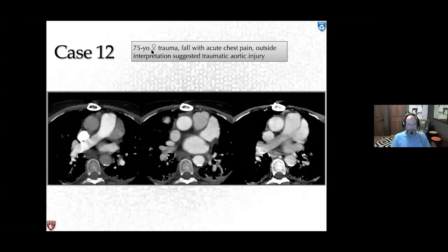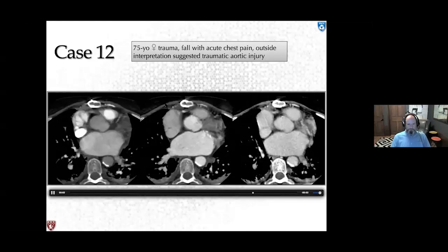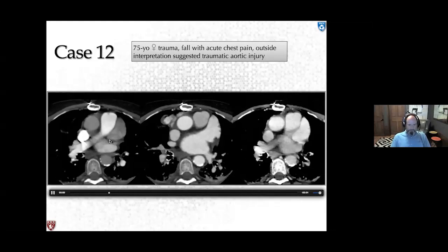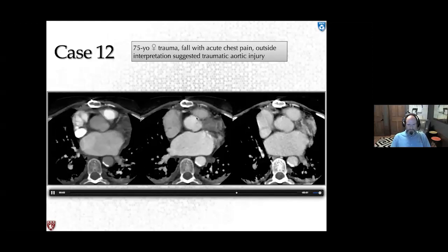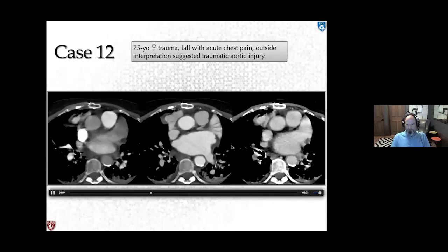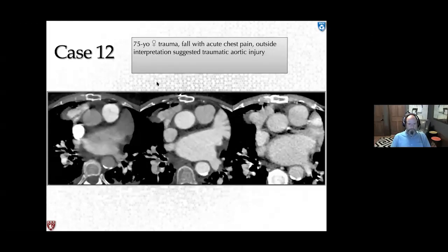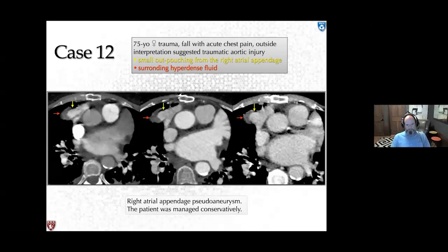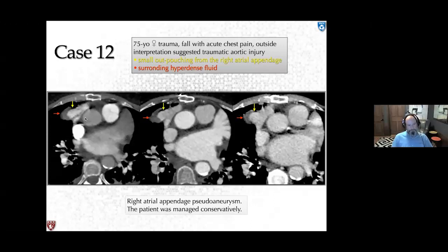Case 12: a 75-year-old female with history of trauma and acute chest pain. Outside interpretation suggested traumatic aortic injury. Three-phase CT showed a small outpouching from the right atrial appendage with a focus of hematoma and surrounding hyperdense fluid — a right atrial appendage pseudoaneurysm, which is very rare. Given the low pressure of the right atrial appendage, conservative management was chosen, and the patient did well.